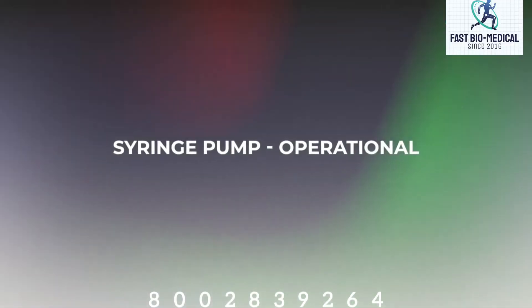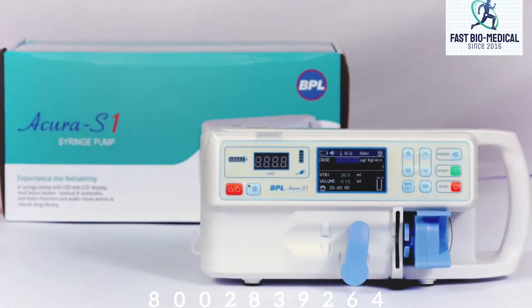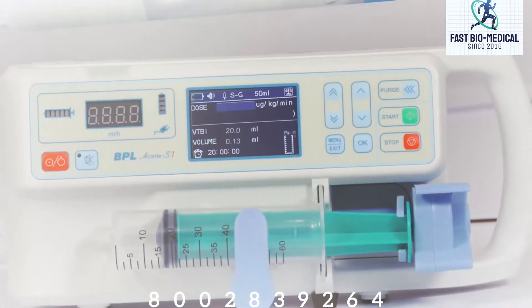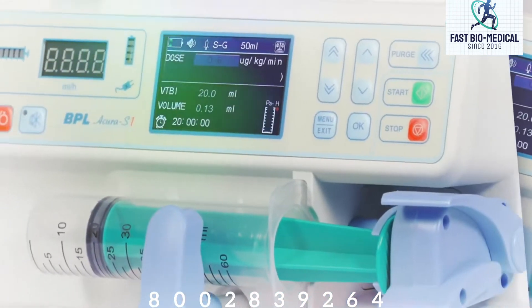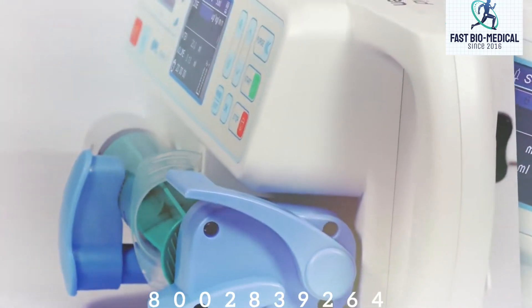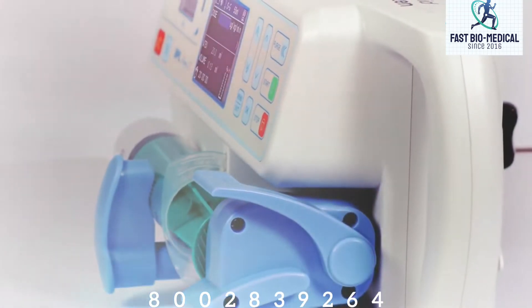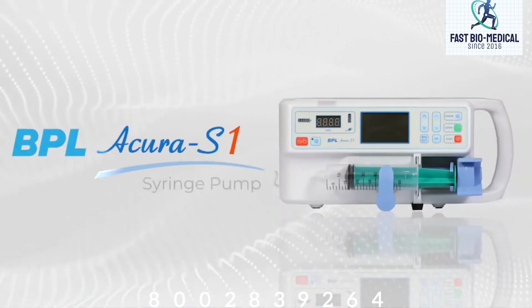In this video we will see the operational part of BPL syringe pump Acura S1. Syringe pumps have been widely used in hospitals to deliver a very small amount of medications into a patient's body in a controlled manner by mechanically moving the piston of the syringe to infuse medication into IV tubing.